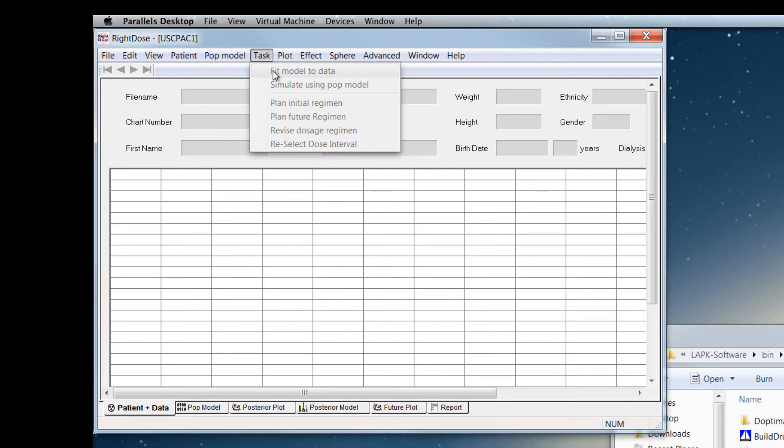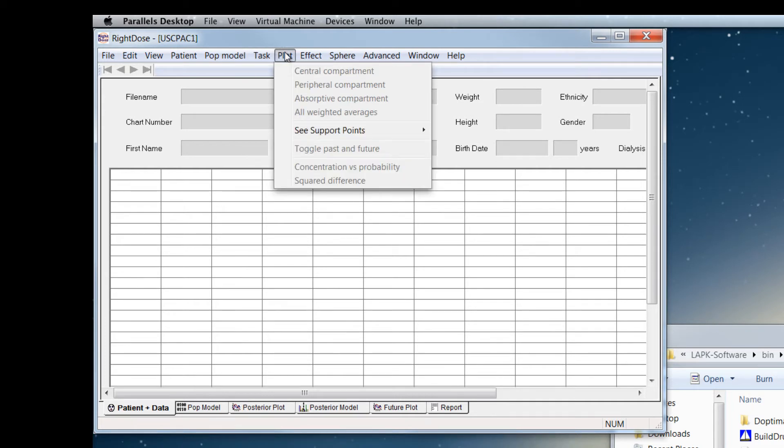And we'll go over other menu items in another tutorial. Plot allows you to control the plots that you see.